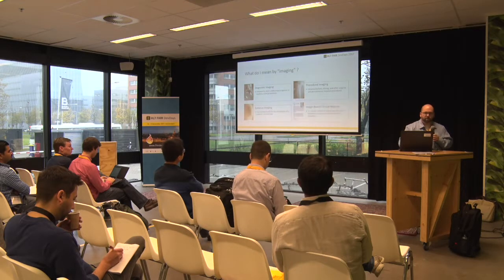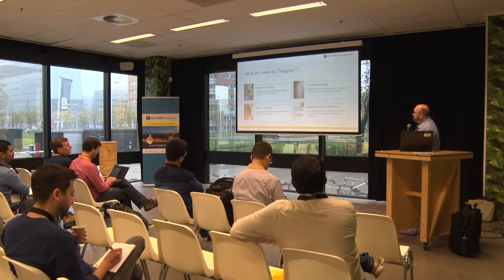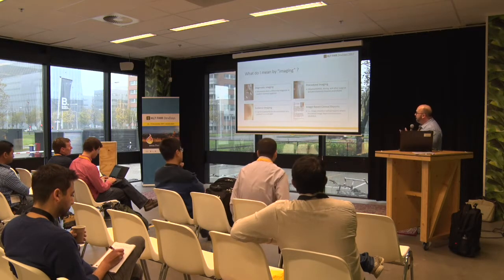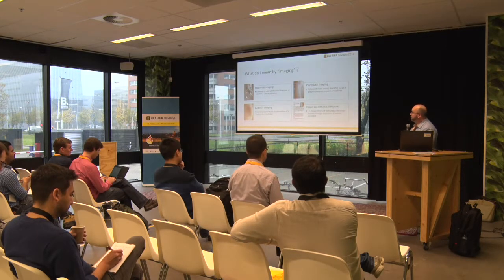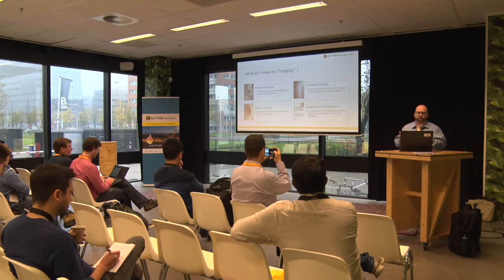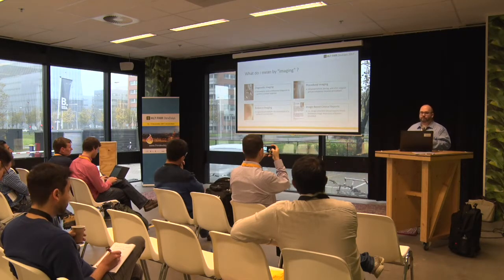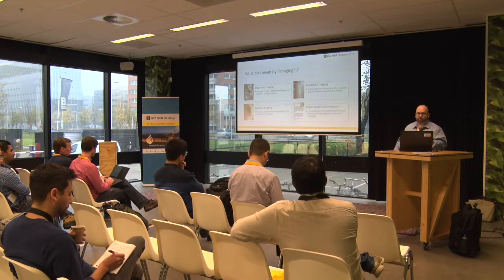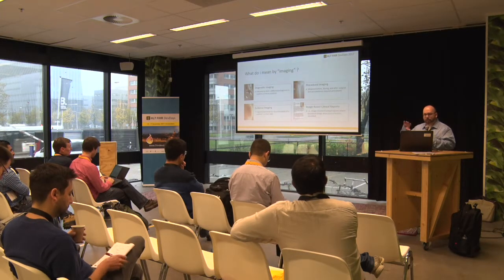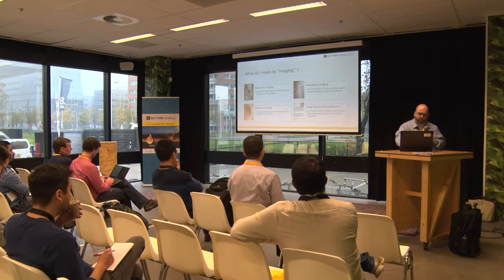So there are really 4 different groups when we look at imaging in healthcare. We've got diagnostic imaging, the classical radiology, where we're trying to obtain a differential diagnosis or confirm a clinical suspicion. But the other groups are evidence imaging, where we're capturing just for documentation of the patient's state, like capturing a wound photo, for example, as well as procedural imaging. So down in the ER, you might have ultrasound looking at muscle tissue, things like that as well. And then also on the reporting side, being able to embed these images and really enrich the textual reports.